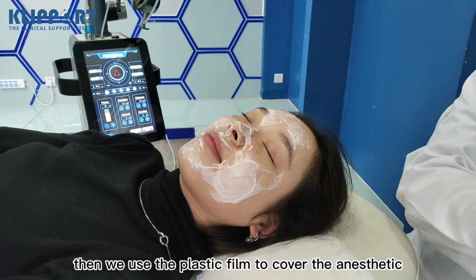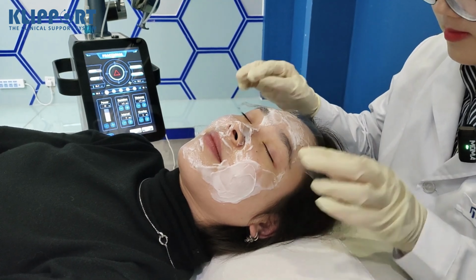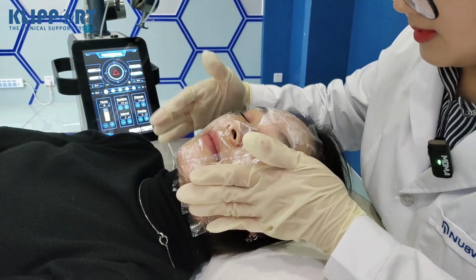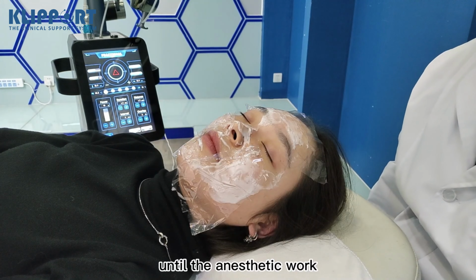Then we use a plastic film to cover the anesthetic. And now we need to wait 30 minutes until the anesthetic works.